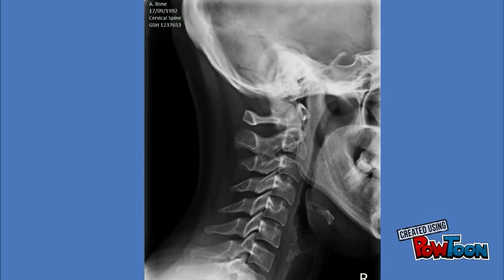The following rules apply to the interpretation and presentation of all X-rays. Always confirm the patient's identity and date of birth. Then identify the type of X-ray and the specific view that you are looking at. Be sure to orientate yourself. There will usually be a small metal marker indicating either the right or left of the X-ray.